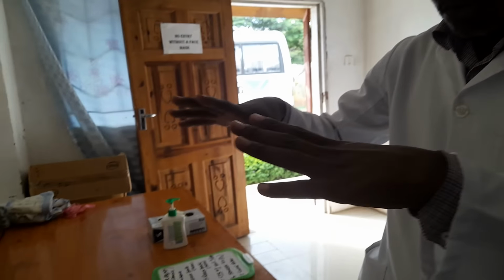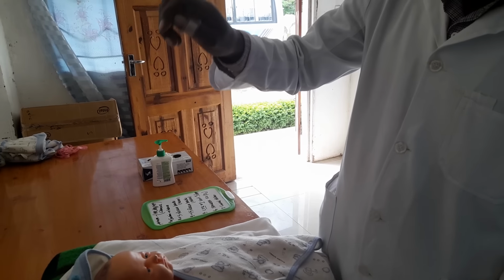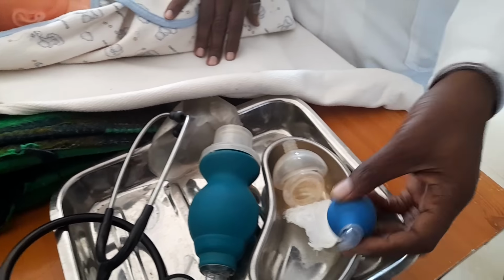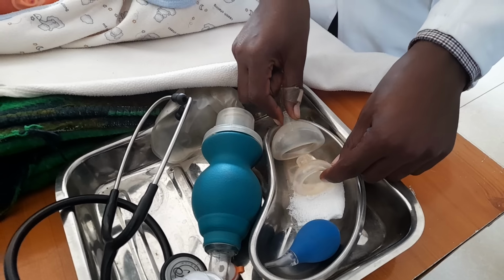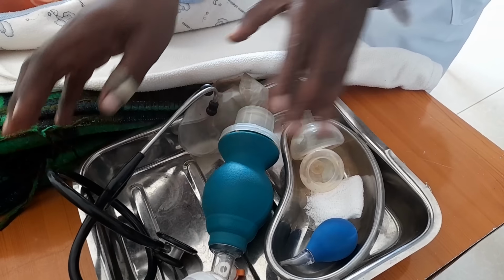For example, the environment should have a resuscitator. So we're just going to imagine that this is a resuscitator for the baby, where the baby is placed. The resuscitator should have a heater and maybe some suctioning unit. If you have all such stuff, then you can perform resuscitation. And on the tray, you should have a penguin sucker, then different types of masks, so that you choose which one fits the baby. Then you should also have the ambu bag as well as the stethoscope.